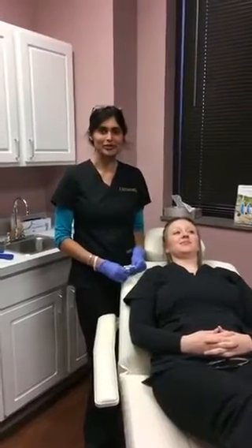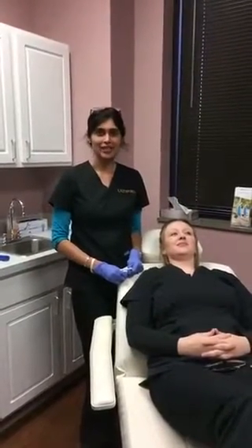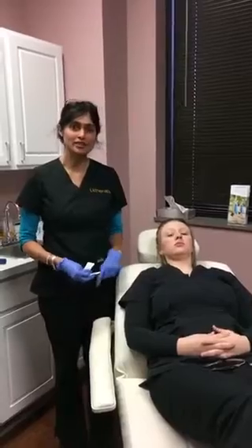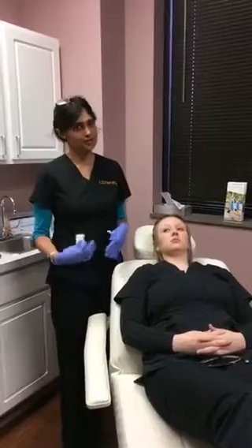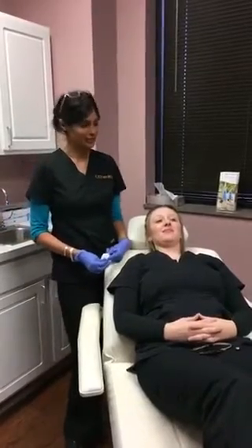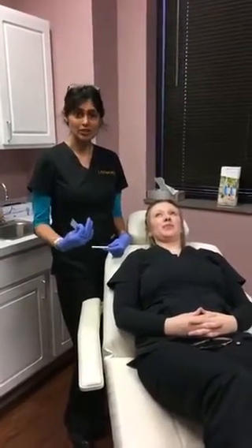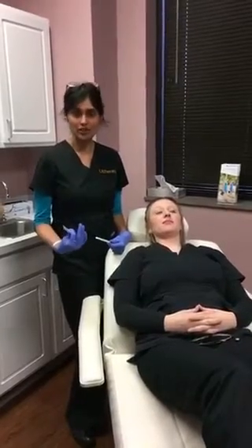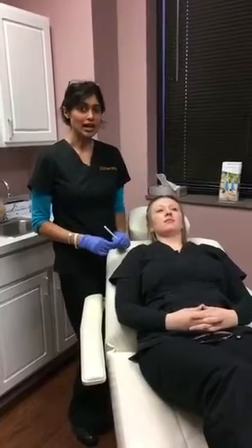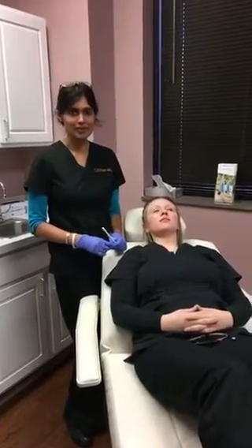We're in Bain Center. Hope you're all doing well. Today we are going to demonstrate how a Dysport treatment is done. Dysport is in the class of neurotoxins, just like Botox. The reason we're using Dysport rather than Botox today is because Lexi has a holiday party on Saturday. Dysport works a little bit faster than Botox in terms of onset of action, and it also tends to last a bit longer — that's what we've found in our patients.